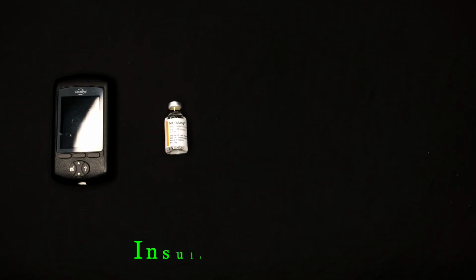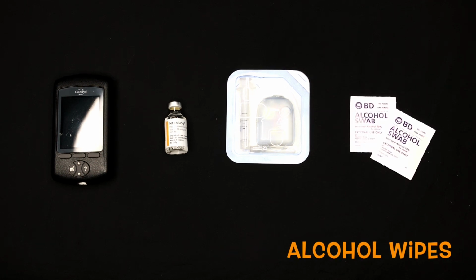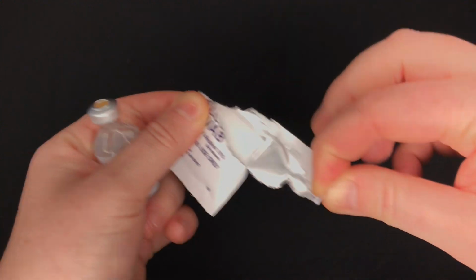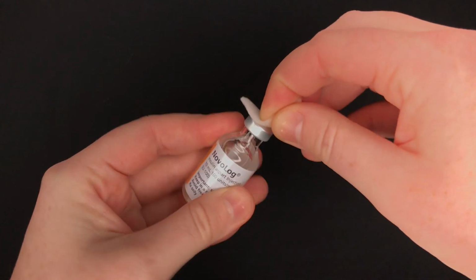There are a few things you're going to need in order to pull off a successful pump change, which includes, pause for dramatic effect, a PDM, personal diabetes manager, insulin, of course, a pump kit, and some alcohol wipes. So a little pre-game before we actually get into the pump change. I like to take an alcohol wipe and wipe down the top of my vial of insulin. That way it's good and clean.